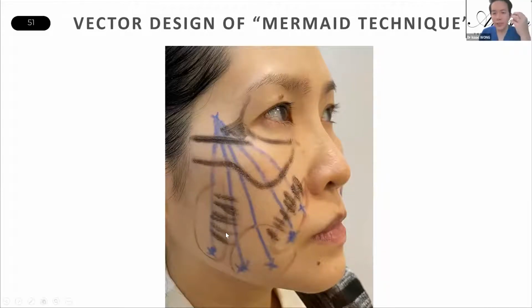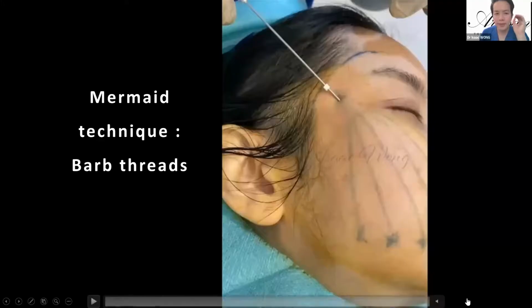So with one thread in the multi-layer Mermaid technique, we can engage multiple structures, and using the contracture effect of threads, the tendency to straighten itself, we get a fantastic immediate lift. So this is the technique. Look closely.